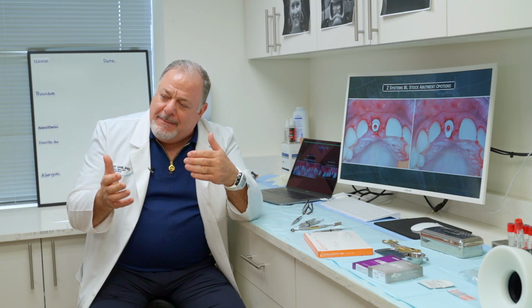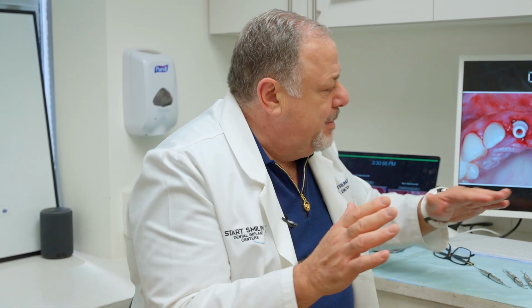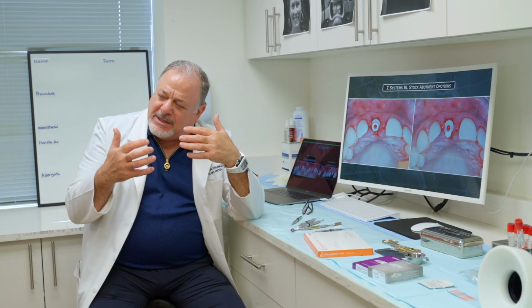That's another thing that it really allows you the flexibility to do and bring the tissue back, without having to worry about excess inflammation or recession in the procedures that you would with titanium. It just doesn't, it's not really a factor to me at this point, okay? But we're going to keep it at the ideal place, and we're going to bring all of our tissue back to where it should be, okay, instead of burying the implant.